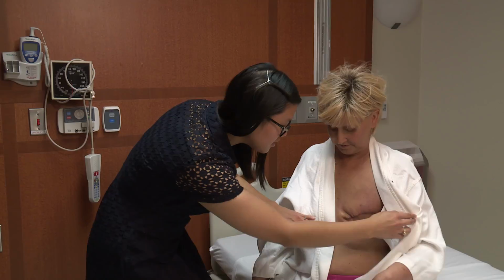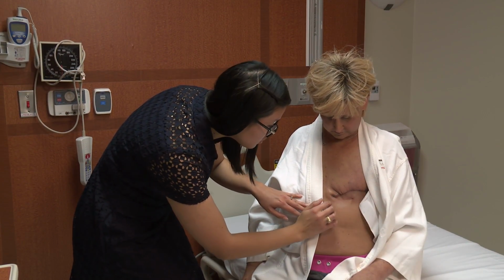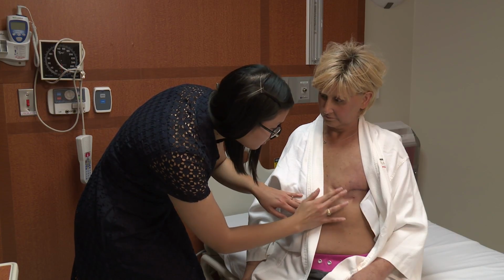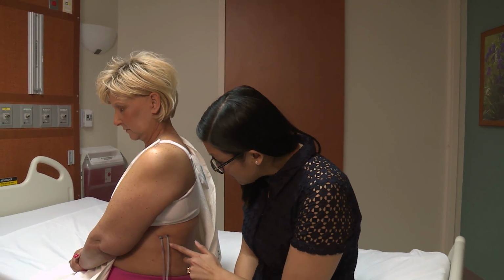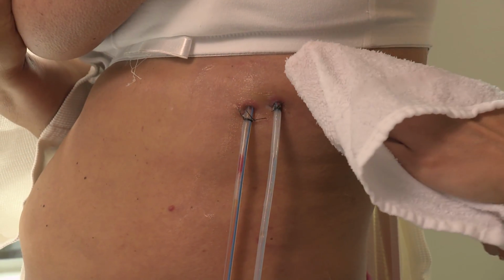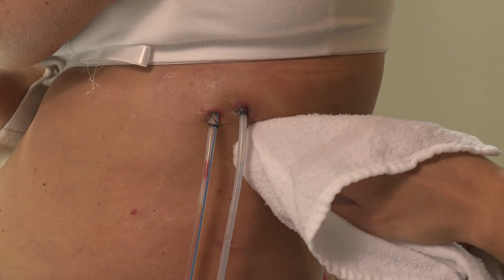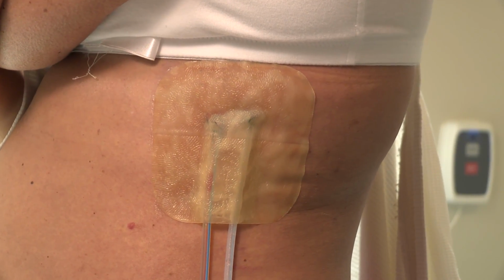There is a risk of infection at the incision site and at the drain insertion site. To avoid infection and help the healing process, it is important for you and your caregiver to know the right method for cleaning and caring for your incision and drain. This portion of the video shows you how to take care of your drain insertion site and the specific dressing your surgeon has chosen for you.